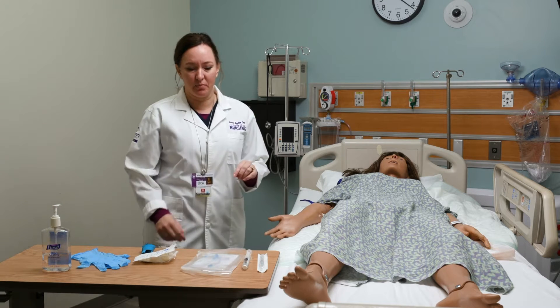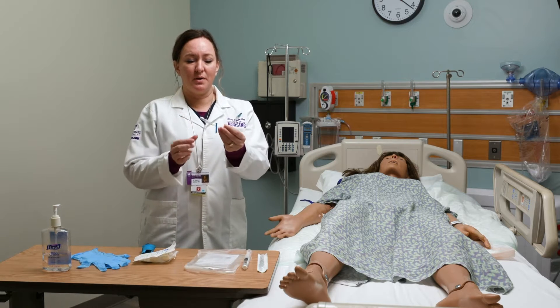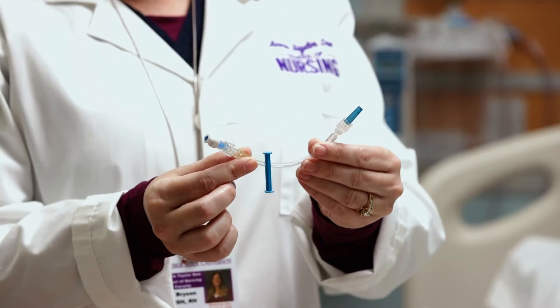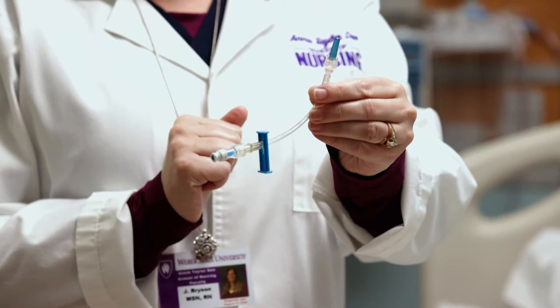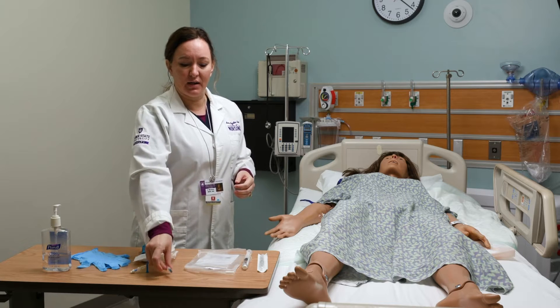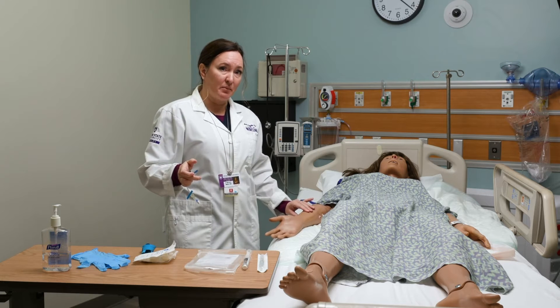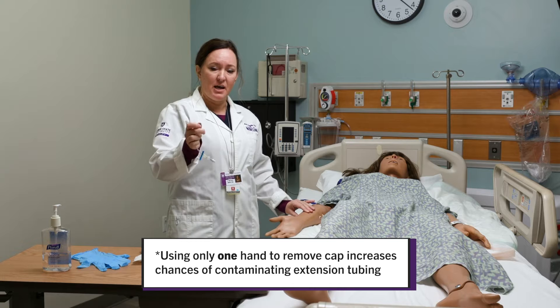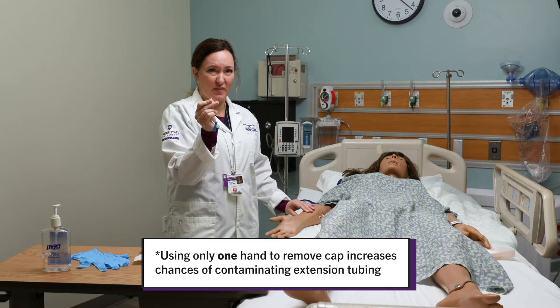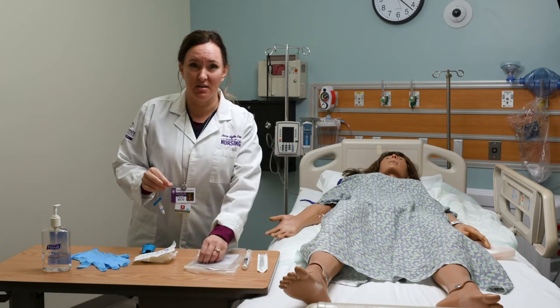The other thing I wanted to mention before I start is that you have a couple of options with your extension tubing. We're going to be priming an extension tubing and attaching it to the IV, and there's a little cap that has to be removed before we can do that. One option is to prime your tubing and set it down, but when it comes time to use it, your dominant hand is probably going to be occluding a vein, so you might have to remove this cap with one hand, which is actually really difficult to do without contaminating it. That is an option but it's not the way I'm going to demonstrate it.